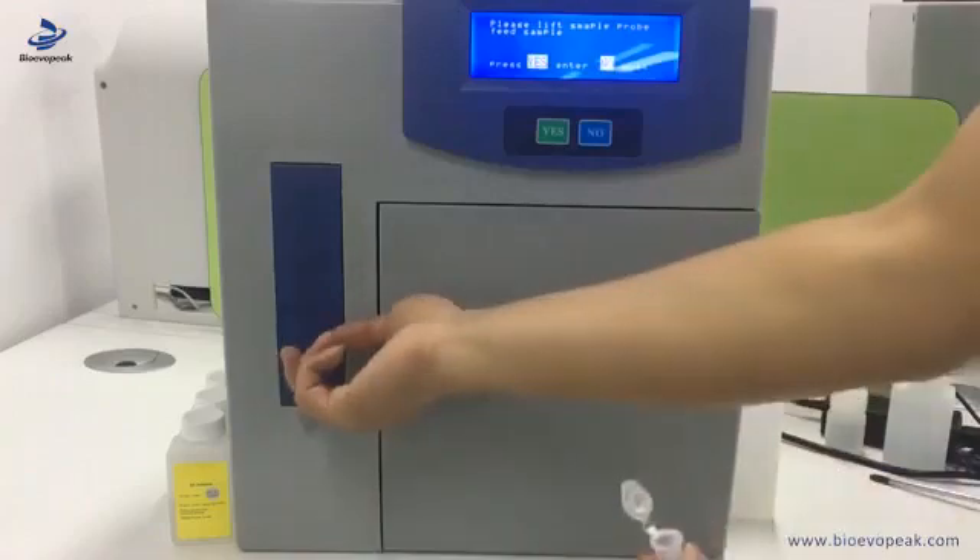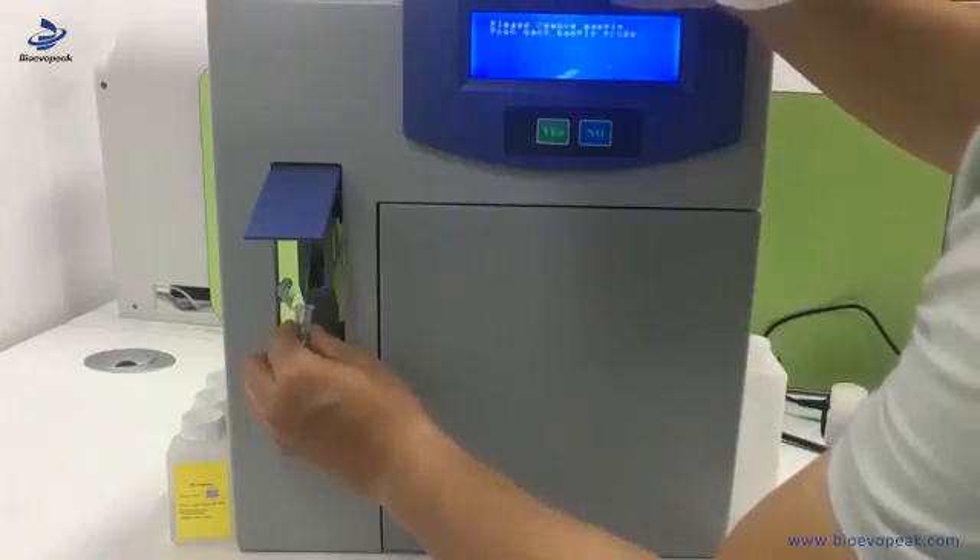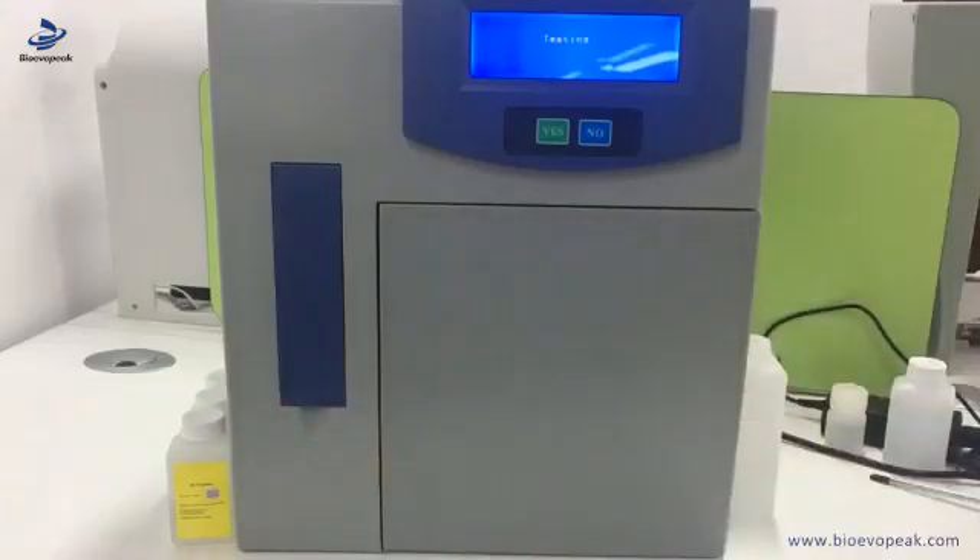For example, if we have several samples to test, this is the second one. We do the same procedure. Now we do the same procedure again and wait. Now it shows the second result.